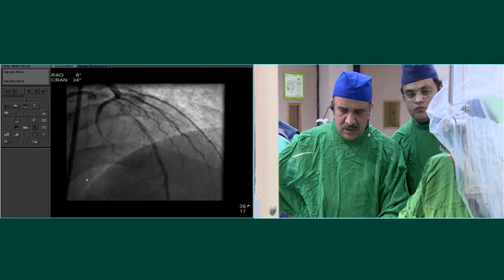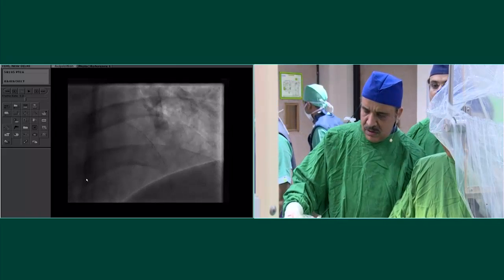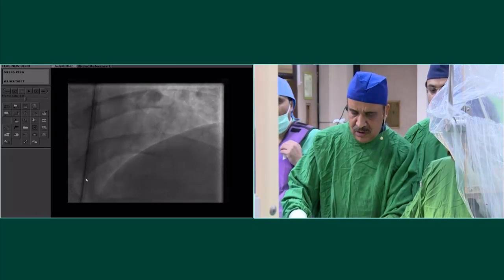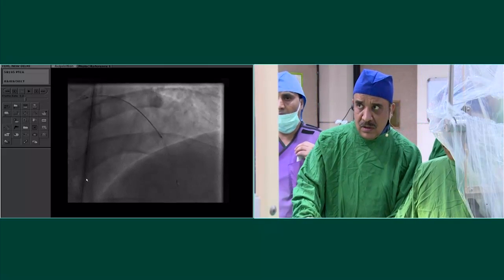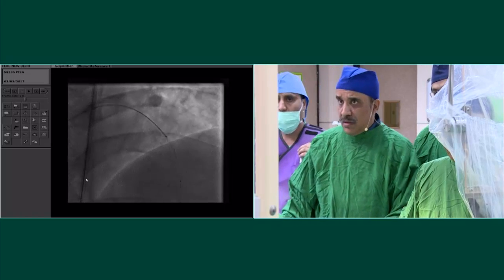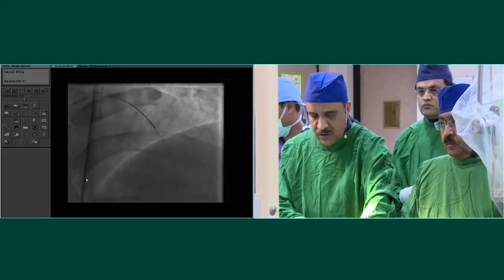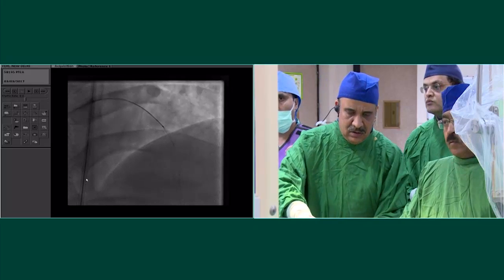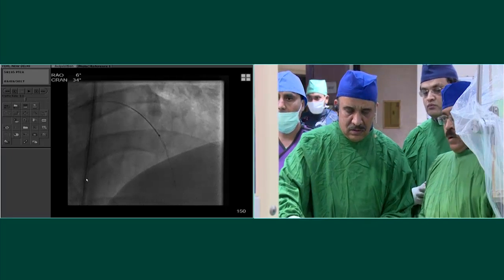Yeah, I partly agree, Ashok. You're doing now a large vessel, and I don't have any issues on this one. For a vessel which is close to 2.5, you're implanting a 2.5, and you definitely want to be sure that your 2.5 balloon is fully open. So I'm a little bit more aggressive for the smaller scaffolds. I want to be sure that they have a very good balloon result. It's more difficult to see if a 2.5 balloon is fully open. So I might be a little bit more aggressive in the smaller vessels.